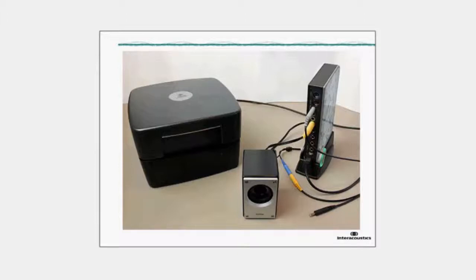I'd also like to inform you of an intended limitation that we've made with the TBS-10 and the Callisto. The TBS-10 cannot be configured with the Callisto to have two free field outputs. This means that you cannot have two loudspeakers and the TBS-10 connected simultaneously. Again, this is an intended limitation, and should people wish to work using this setup, then we recommend they look towards the Affinity.